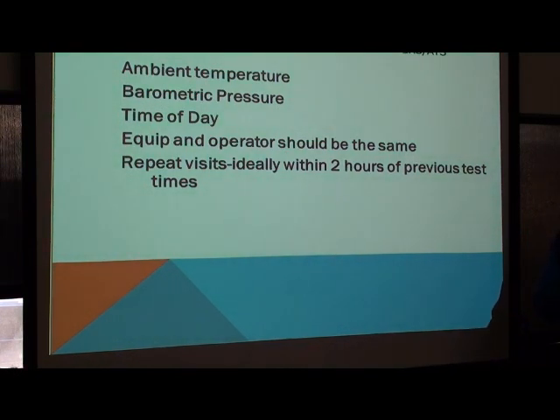It was caught by a biological control before any testing, before any patients had been tested on that system. So again, that's the value of doing biological controls. This was a calibrated system, but unfortunately there was an error made in an entry of a key environmental parameter.